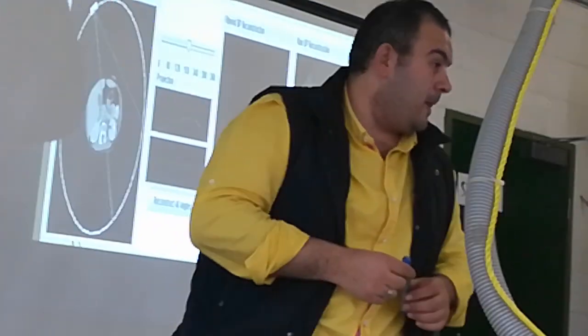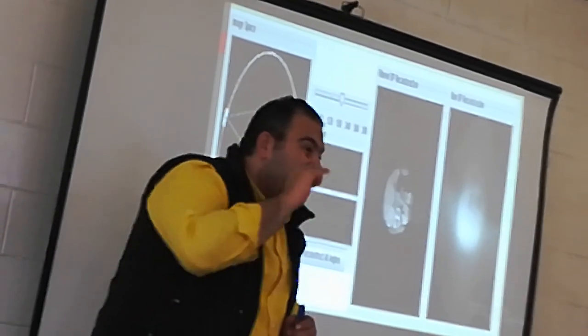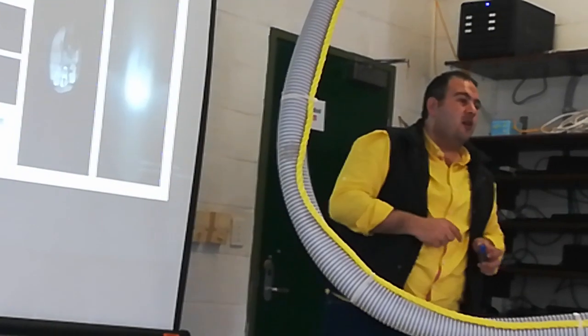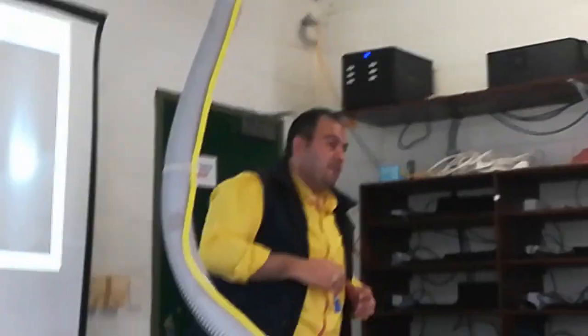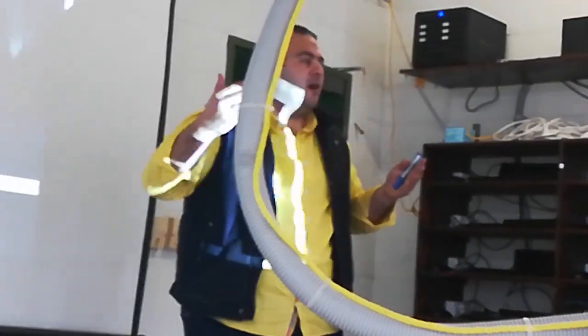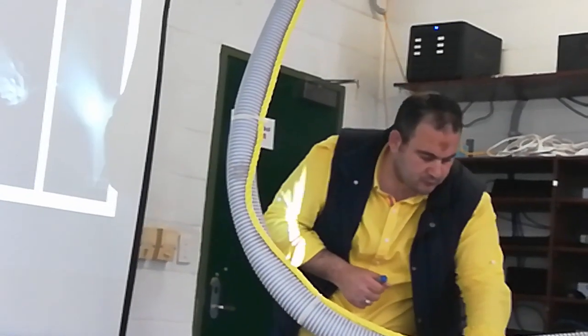Nowadays another reconstruction algorithm is used, called the iterative reconstruction algorithm. It is used with low dose. You can scan a patient with very low dose and remove the noise of the image using this algorithm. We already have one in our machine, called iDose. You will find a different commercial name in Toshiba, called AIDR 3D, and other names in different machines, but the same concept. The main idea of this algorithm is to reduce the dose and overcome the noise of the image. But this is software.